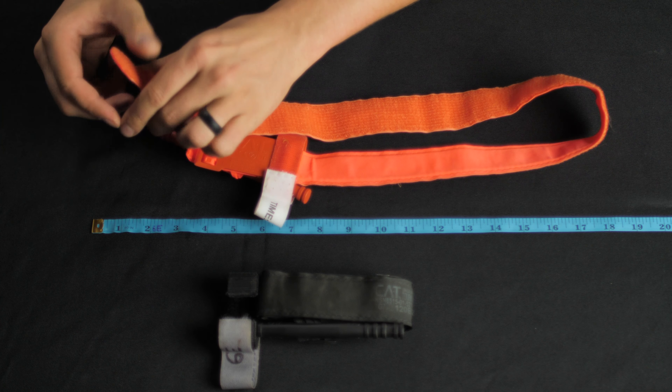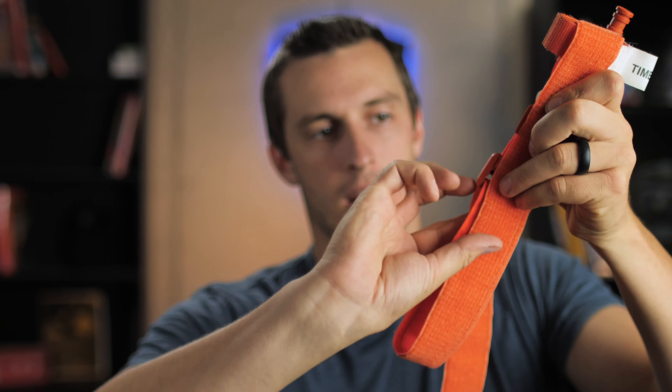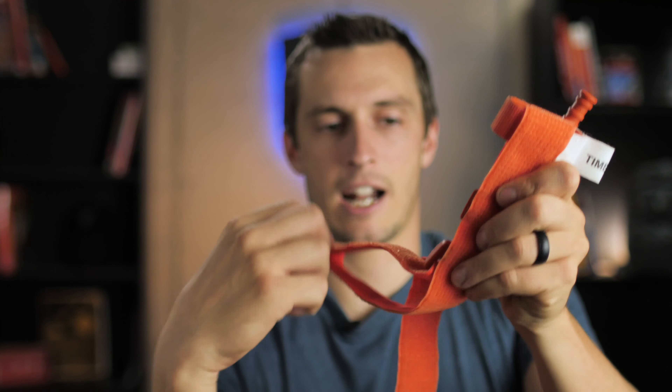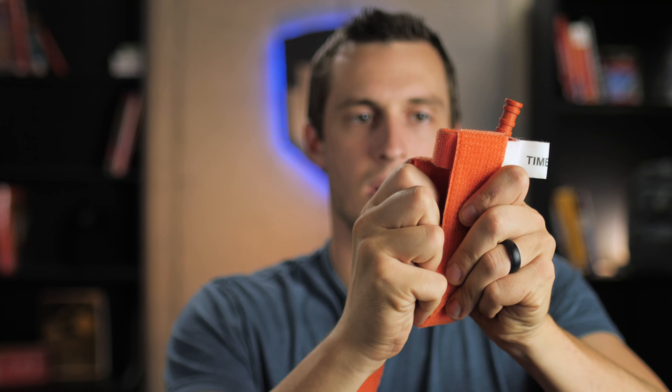Take this, loop it through the buckle, and pull about halfway back. This is going to be a little bit of trial and error — take this bite or loop here of the tourniquet, fold it up, and eyeball it to where it fits just up underneath this clip. If it's too long, pull a bit of slack back out, then fold it again and see if that's close. That's going to get me pretty close right there.